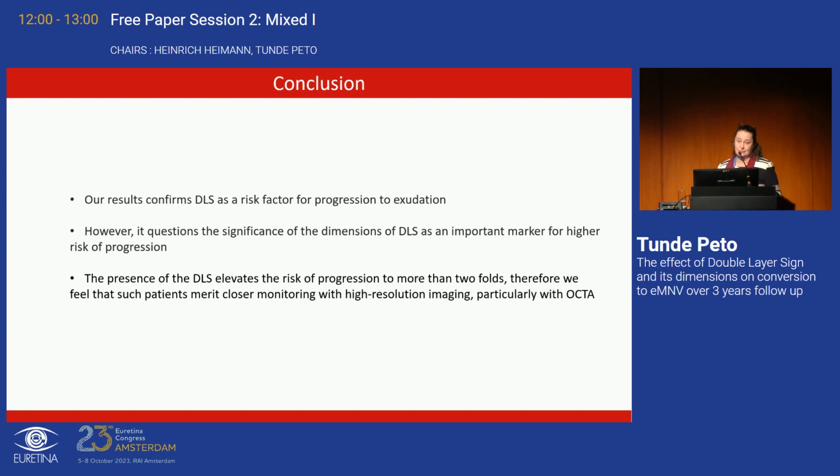So if you grade for it, then these are the patients that you might wish to follow more carefully, and monitor more carefully with high resolution imaging and OCTA. But as I said, we haven't graded OCTAs in this study, so I can't tell you just yet. We are going into that as well, and we'll be able to present it next time, hopefully.